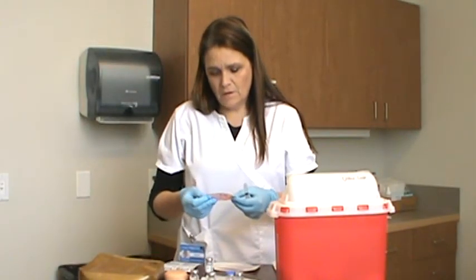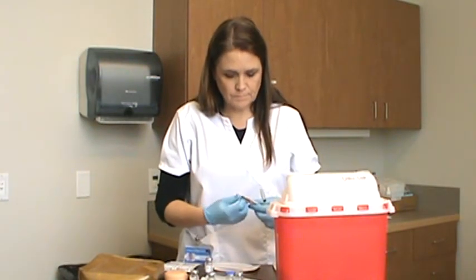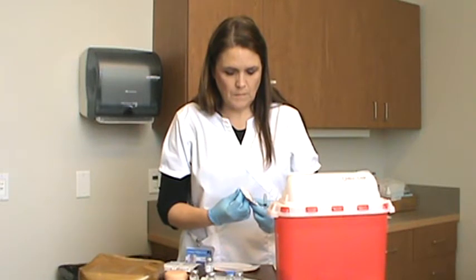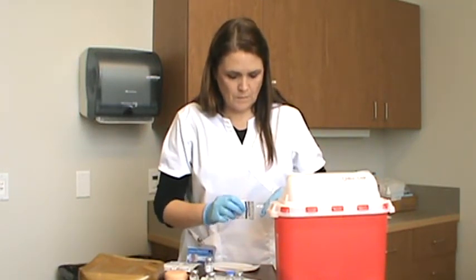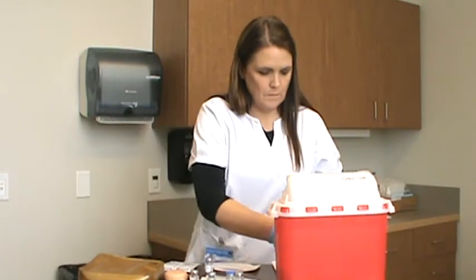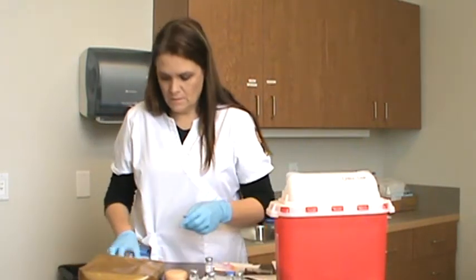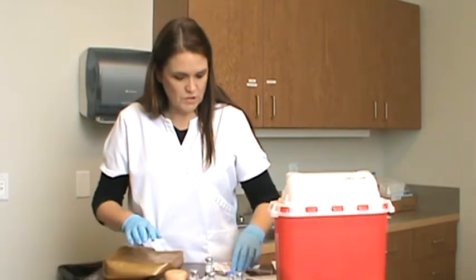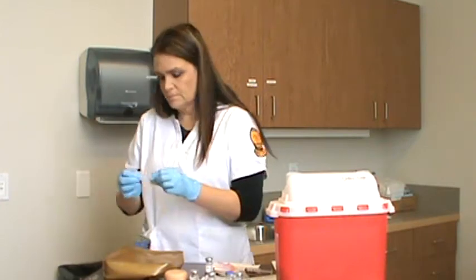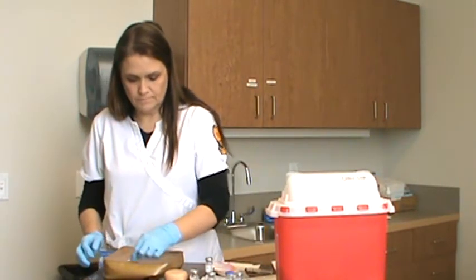And I'm using a 25 gauge. Okay. And you can give this in a Z fashion, where she would wipe this off from the inside out.